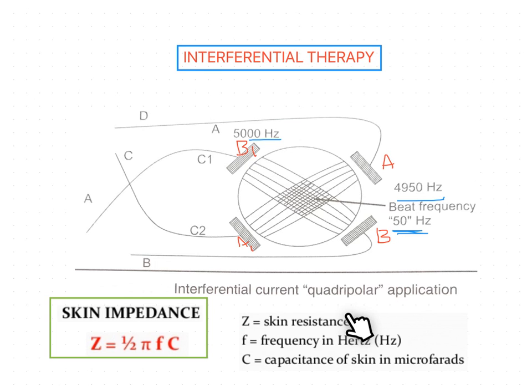So this is why we are using medium frequency currents in interferential therapy.